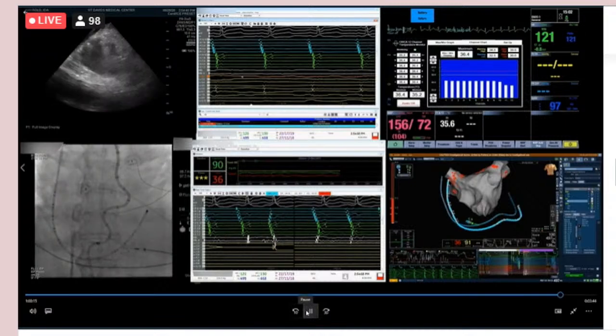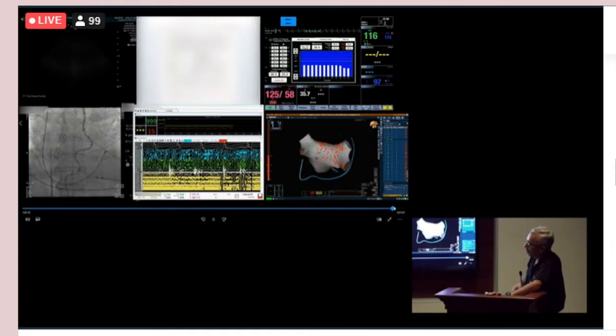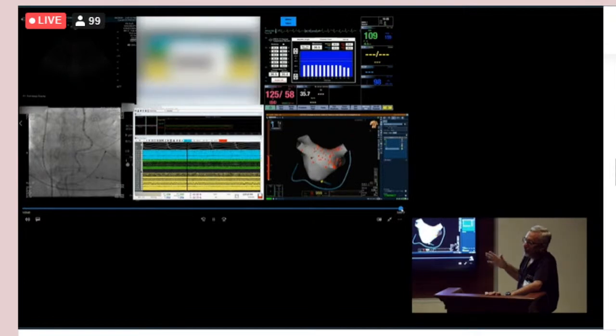There is a question. Is there a reason why he used the lasso over the HD grid? Yeah, there is. I think the HD grid is really a nice catheter for atypical flutters. It's a really nice catheter for VTs. But I find for just the standard AFib ablation, it's kind of unnecessary. And then the other thing I find is that in order to know that you've isolated the vein, you have to keep moving it around. Whereas if I put a lasso in, I'll know immediately which segment of the vein needs some attention. So for me, it's a lot faster to simply use a lasso rather than the HD grid. I think it's a nice catheter, but you're taking something and making it more complicated, is the problem.